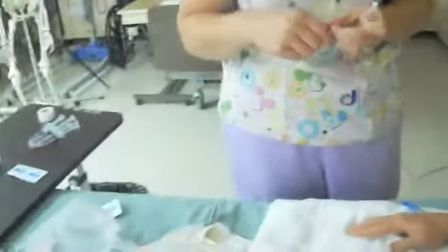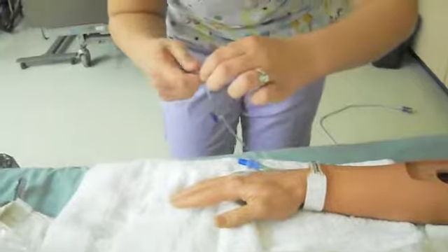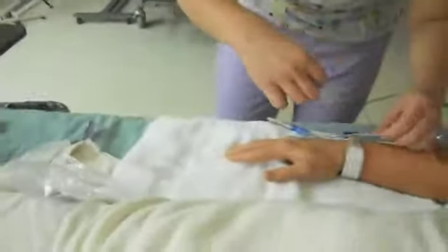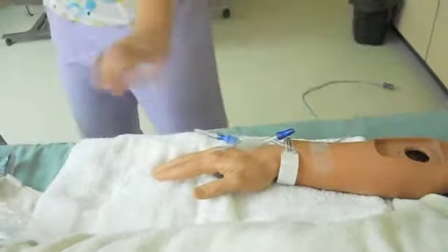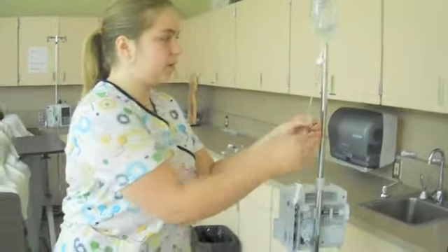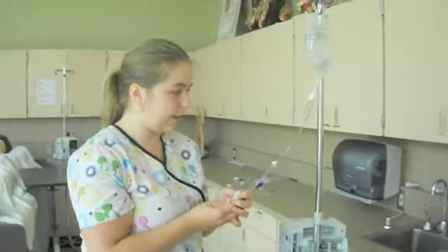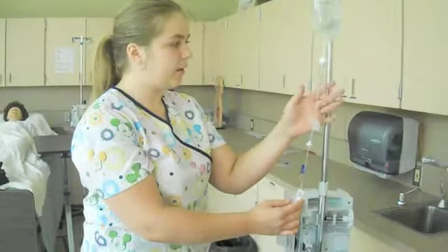Next we're going to scrub the connector again with alcohol, maintaining sterility all around. Then I'm going to uncap this and connect it. I'm also going to put my label on the tubing because it does have an expiration — you don't want to use it too long, so I'll write my date and time. I'm also going to label the bag saying when I put it on. Then I would check the doctor's orders and set the drip rate accordingly by adjusting the flow control, counting the drips to make sure it's set up properly. Okay, we've got our drip rate going.